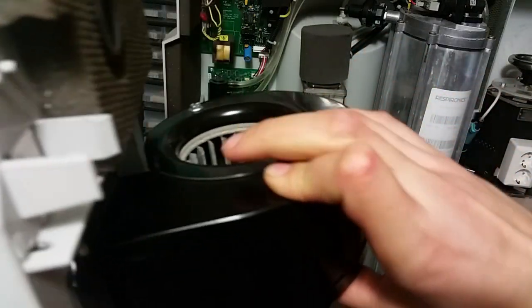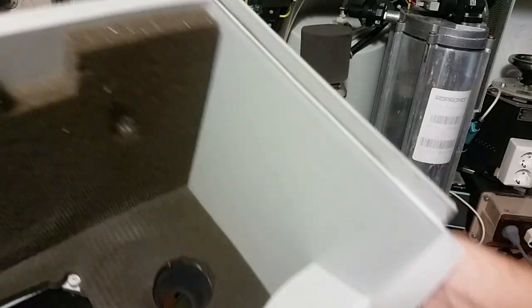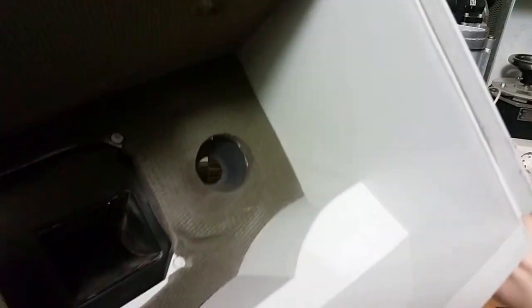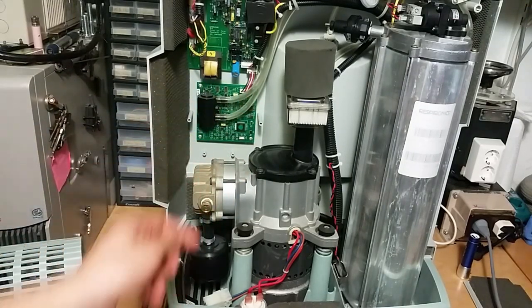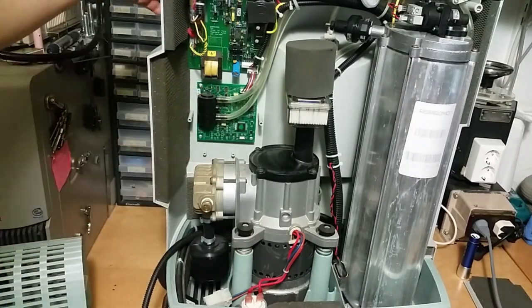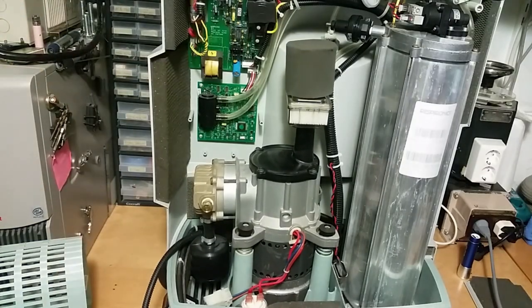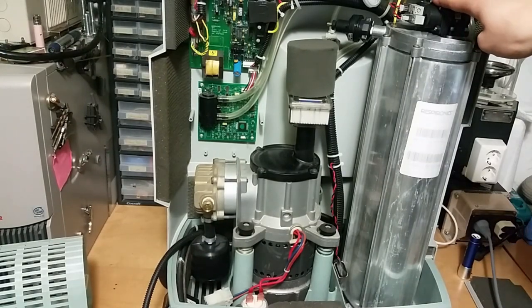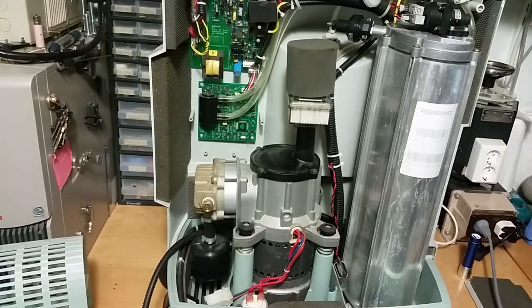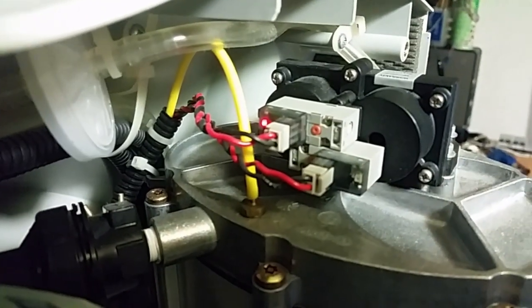This is how the housing looks. Here's the squirrel cage, and inside you can see more sound insulation. Now we can also see the circuit board for the oxygen sensor — that's the actual oxygen sensor here. I want to turn it on. You can see the compressor is running, and you can slightly hear the valves changing. And here you can see we've got LEDs on the valves, so you can see how it's operating.